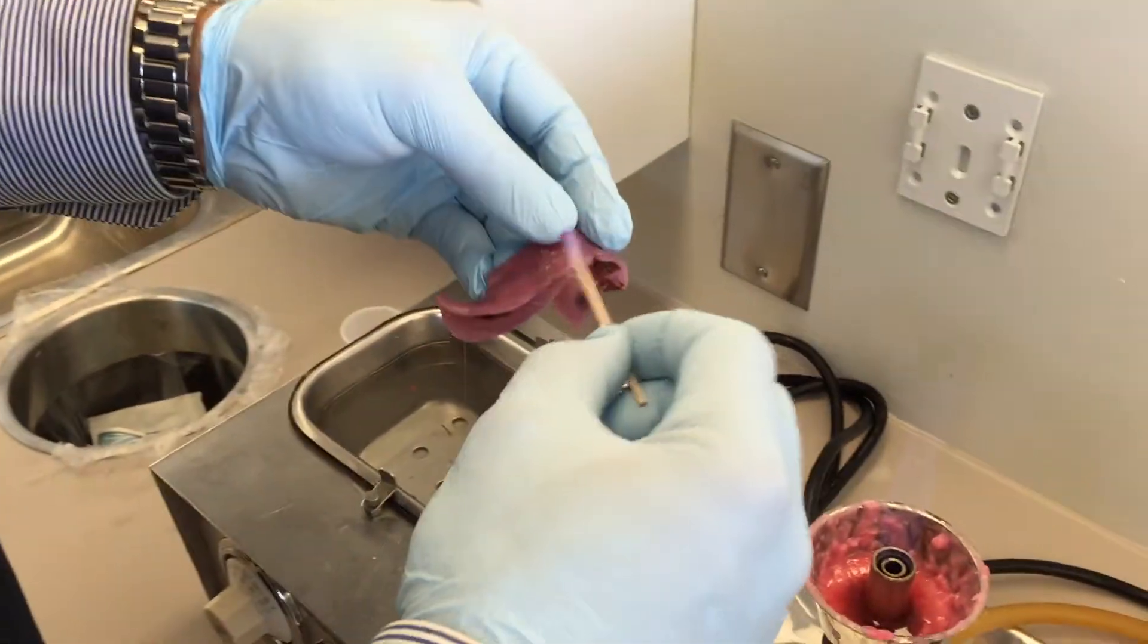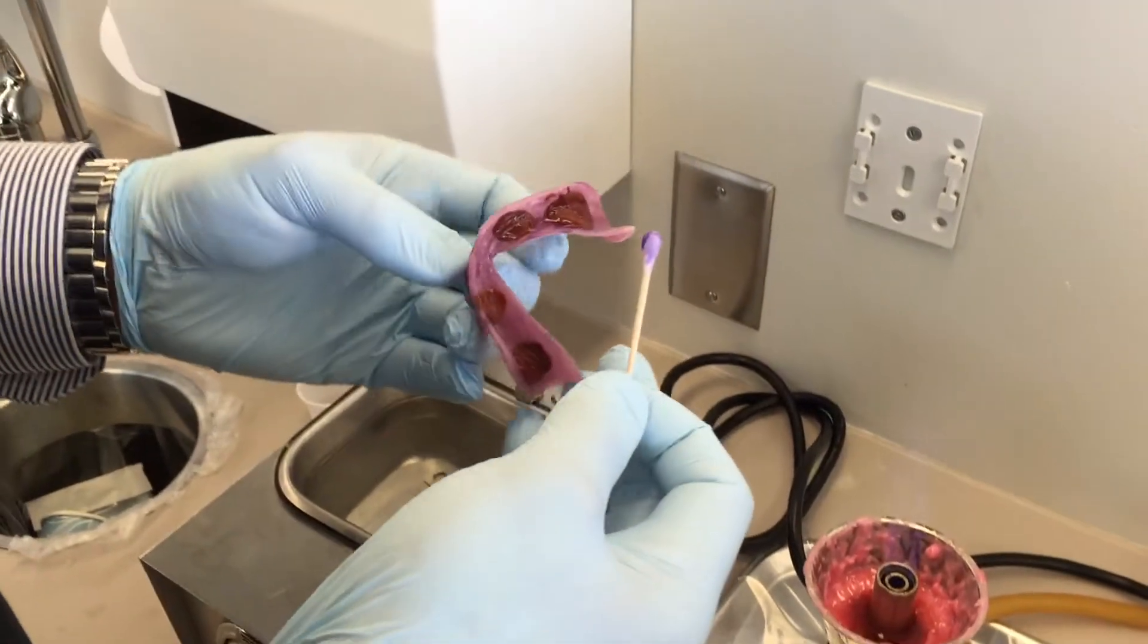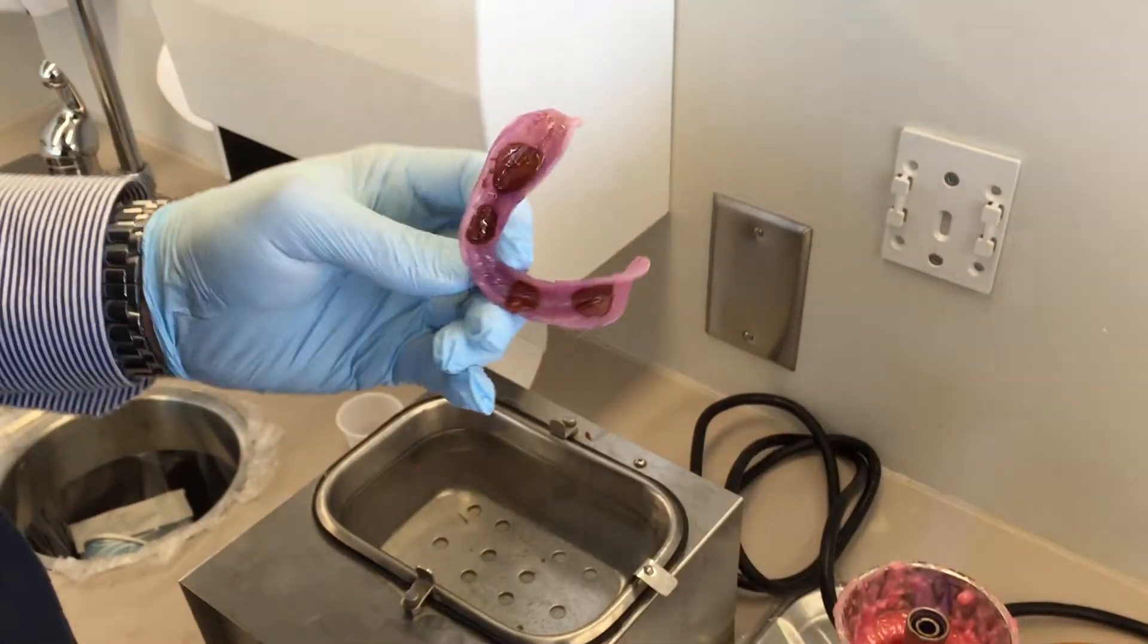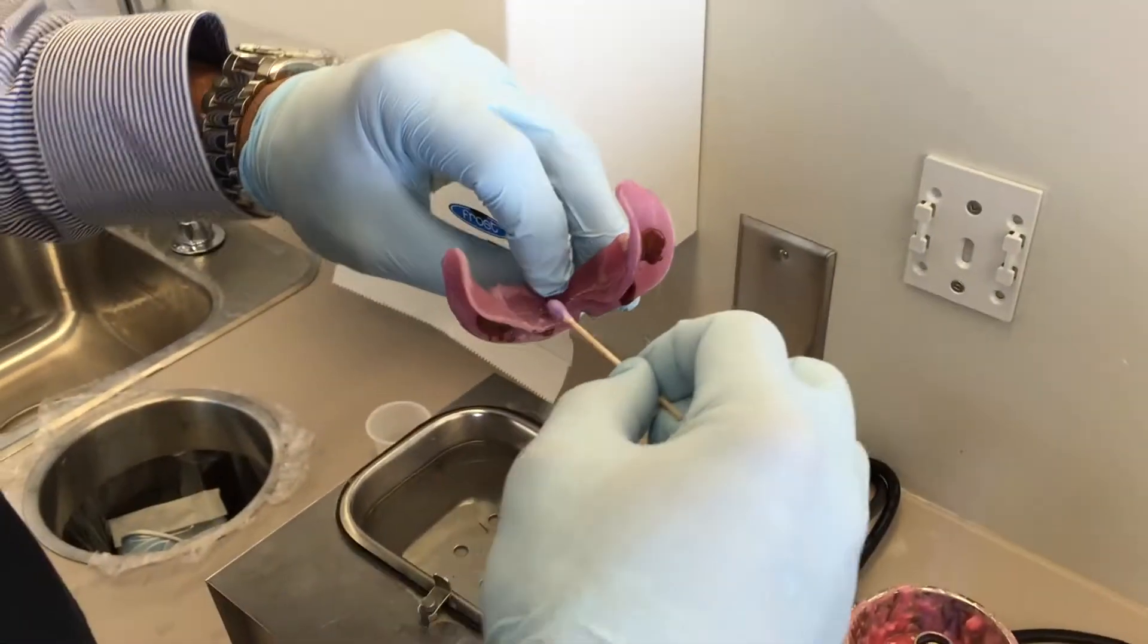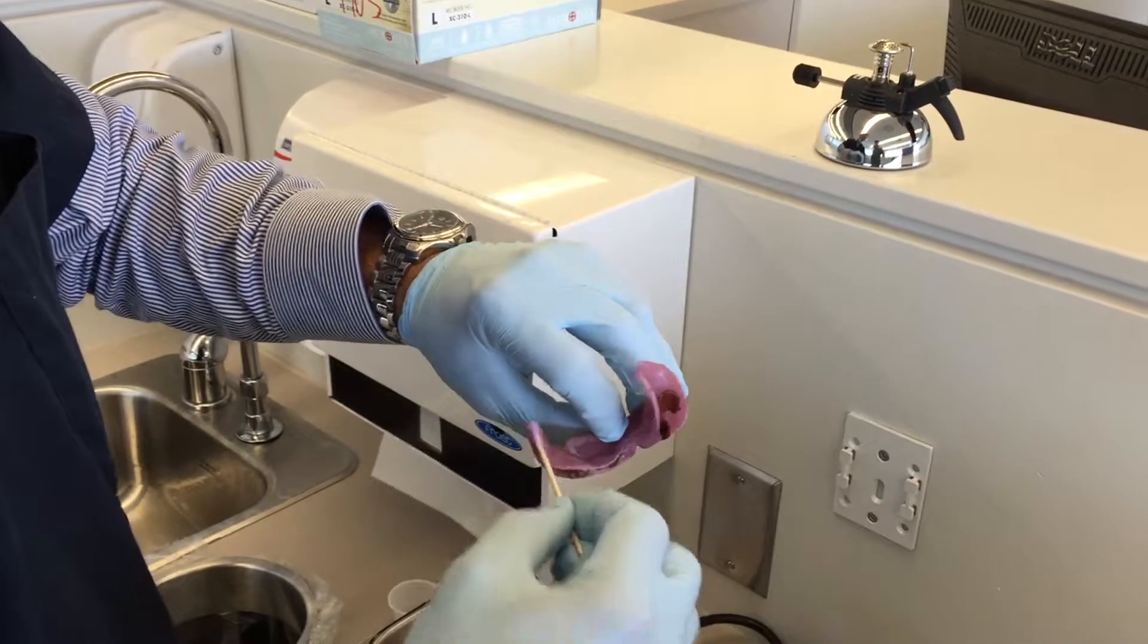Because the PVS material will not bond to the tray material, and if you don't get a nice bonding between the two, you will get some distortion as you try to remove the impression material from the patient's mouth. So I don't want that to happen.